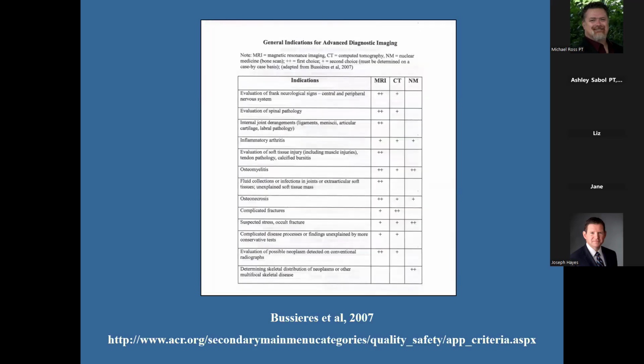And then the second half of this form really talks about now indications for more advanced imaging. This is a musculoskeletal themed talk, although the practice patterns are broad that this could apply to. But the bottom line, when you think about MRI, you're thinking about soft tissues. You're thinking about muscles. You're thinking about tendons.